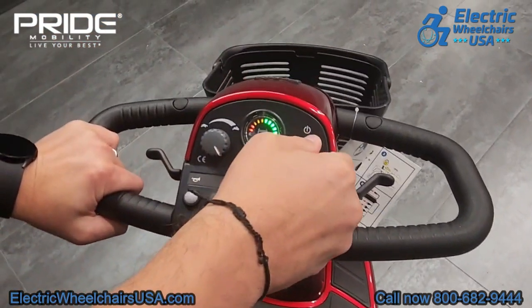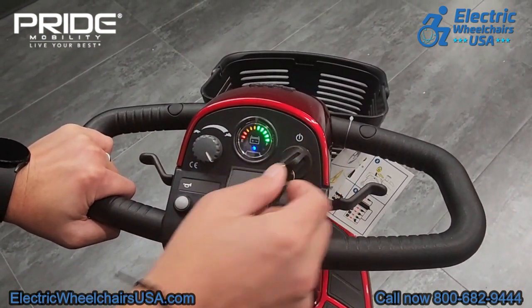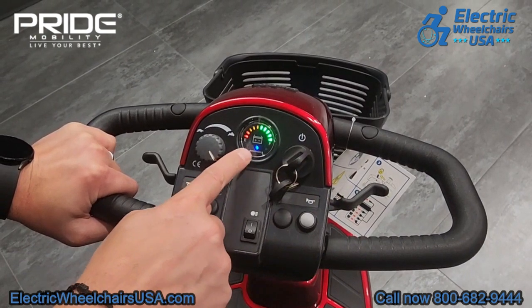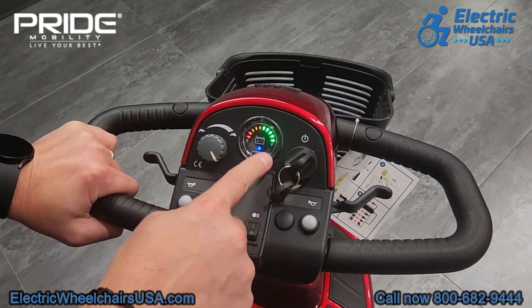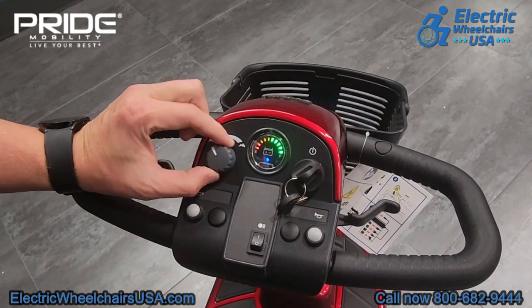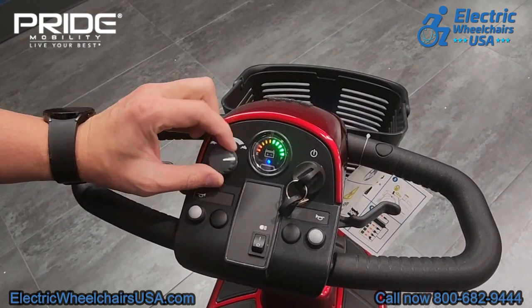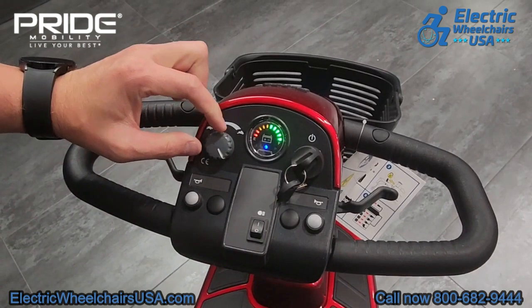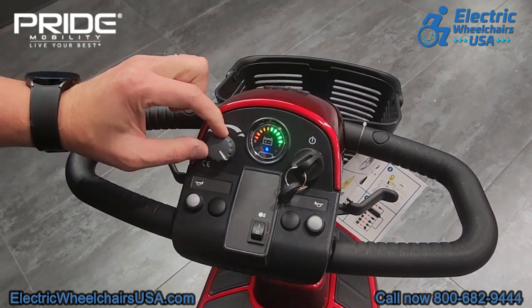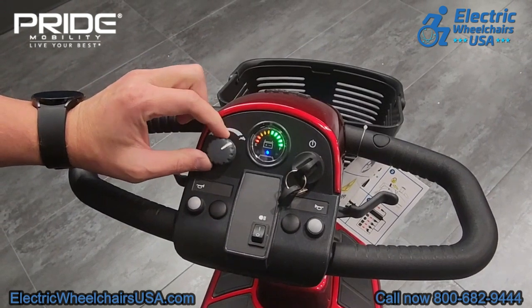On the tiller of the Victory 9, it comes standard with two keys. This is the battery gauge — right now it's fully charged. You can see when it's time to recharge, each of these bars will start to disappear. This is your speed control dial. If you turn it all the way to the right and fully accelerate, the max speed is around 5.3 miles per hour. If you turn it all the way to the left, that decreases the maximum speed to about half of that, around two and a half miles per hour.